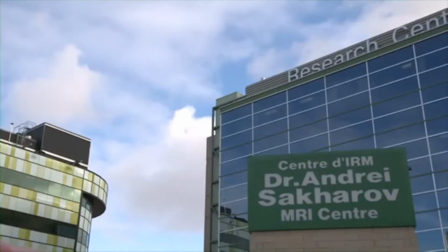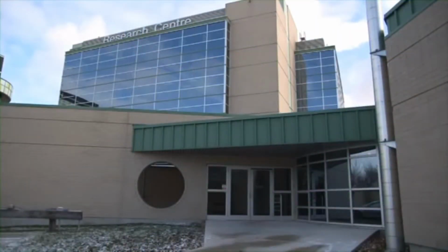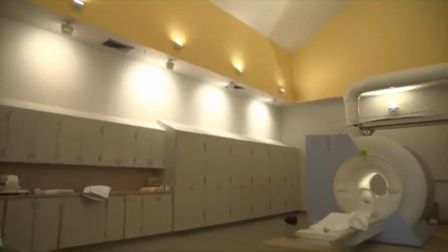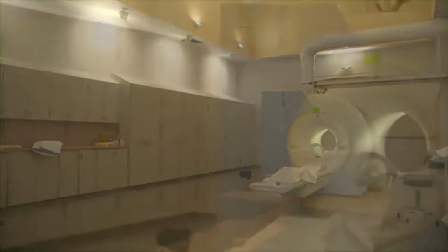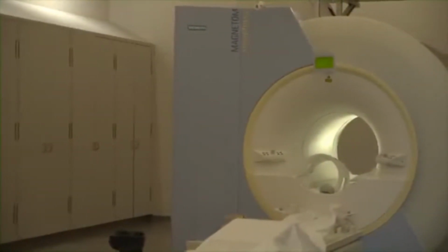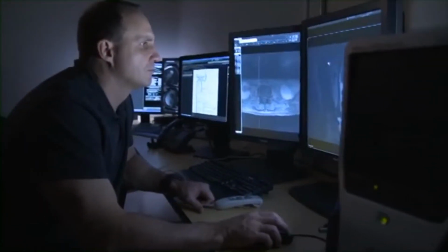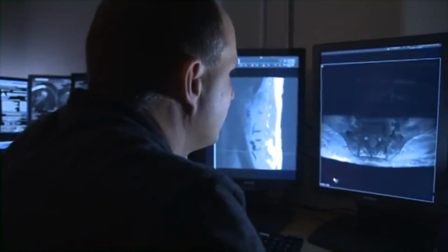It also helps us in our productivity in terms of our workflow and management. They give a work list from the RIS system, the radiology information system, directly into the modality, the CT scanner or the radiography unit. The list includes the patient's demographic information and health and identification numbers and so on. So there's no errors with data input, and the technologists can spend their time doing the examination, looking after the patient instead of having to put in all of that data into the CT scanner.